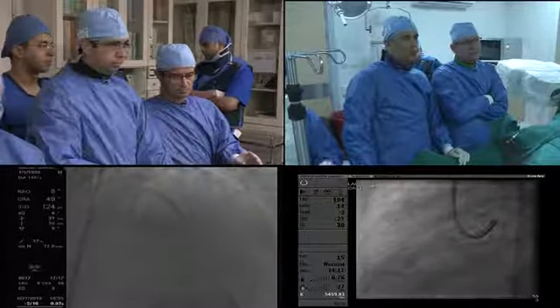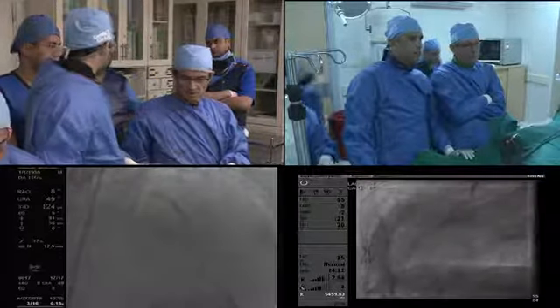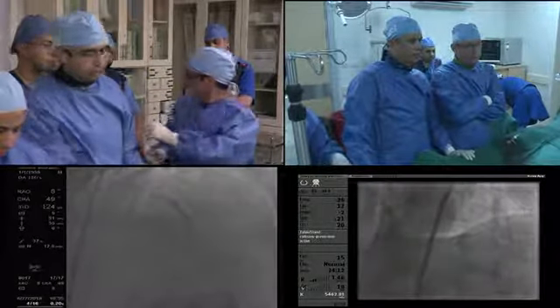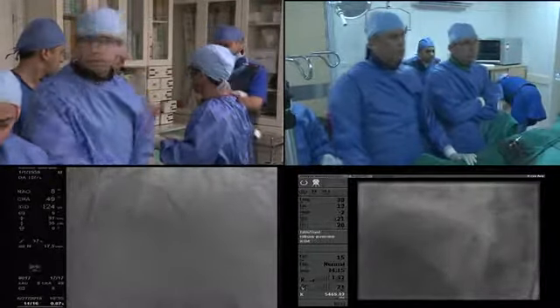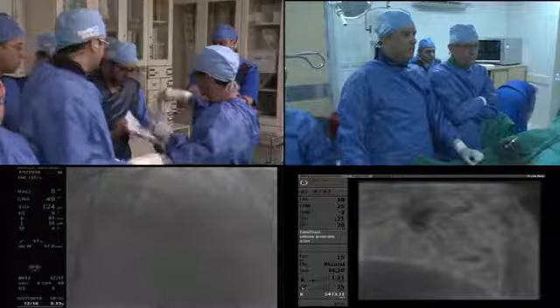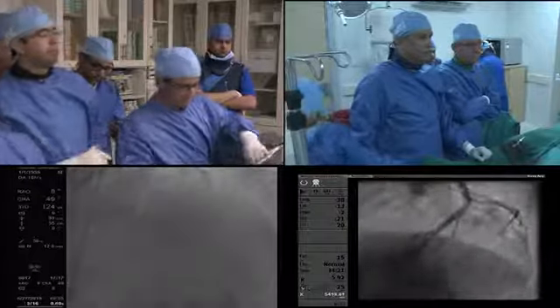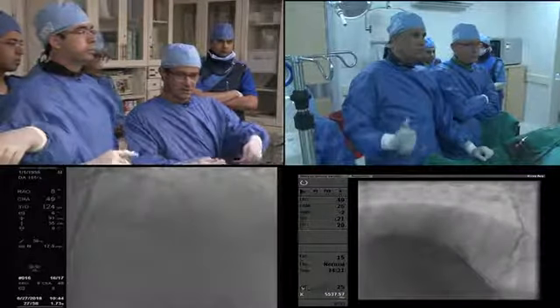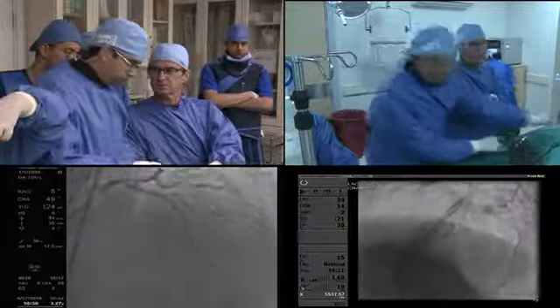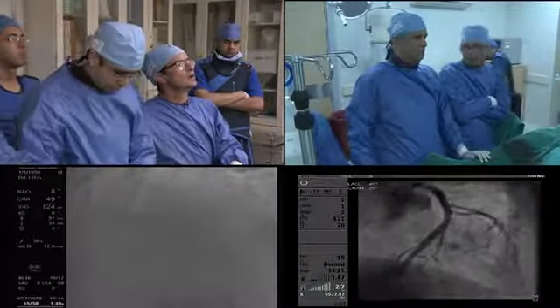Take a final picture, Ayman, and that's it. Not yet, because we are about to put the stent, after the pre-dilatation. Yes, Dr. Amr, I can hear you. Hold your breath and take the last picture. And by the way, we broke the balloon. Thank God, safe, Saeed. Normal breathing. Thank God. Thank you. Yeah, it was very nice.